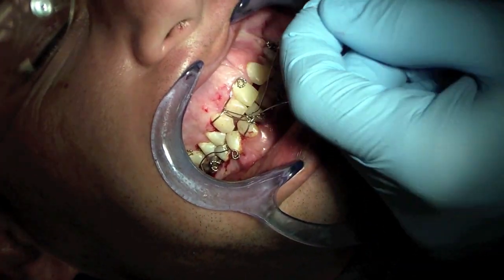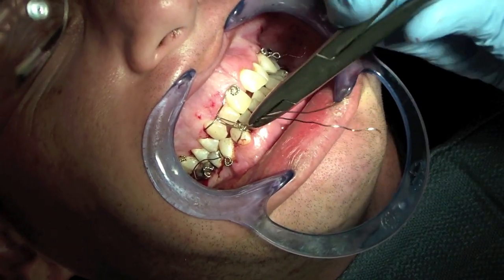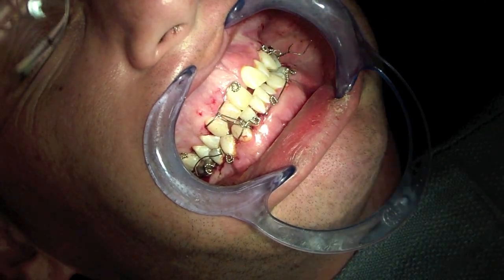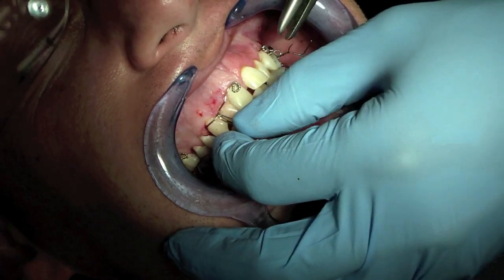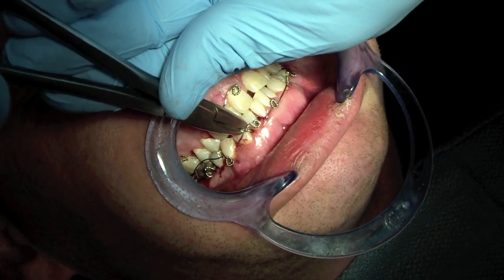So it's just a short little amount to make a rosette. I go back in thinking I could lengthen the wire and you'll see it go click — there it is and it breaks. So just a good learning experience. It's fairly straightforward but after an hour and a half you're getting tired. Cheers.